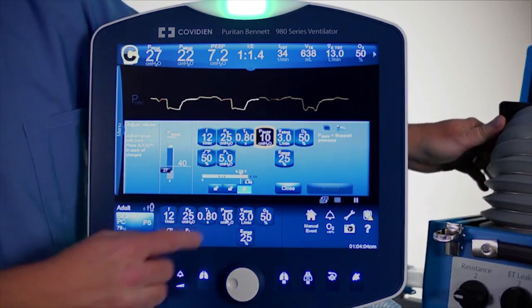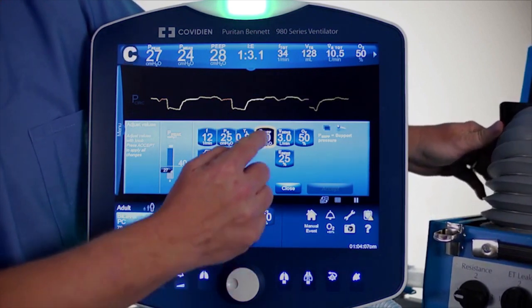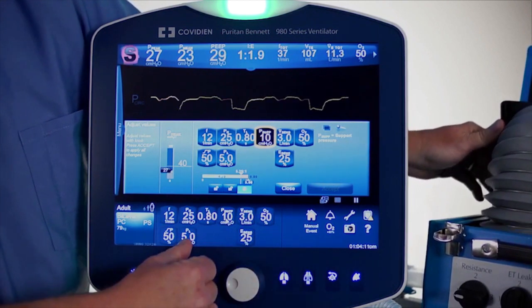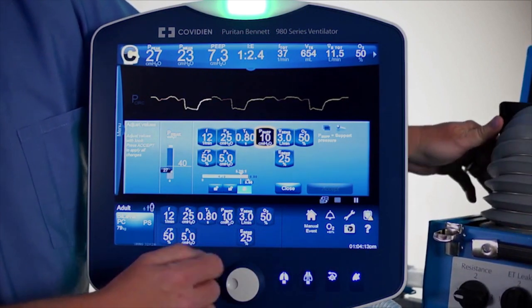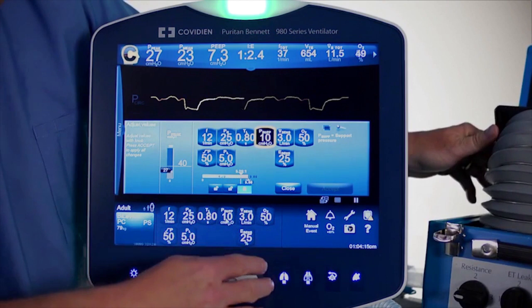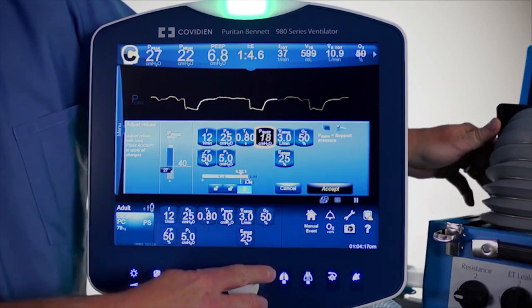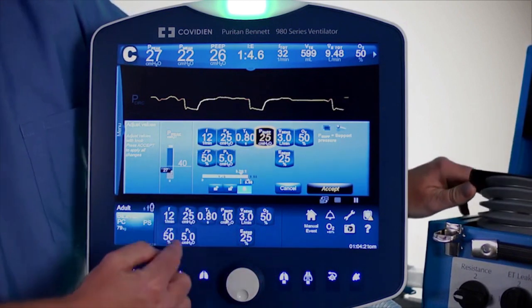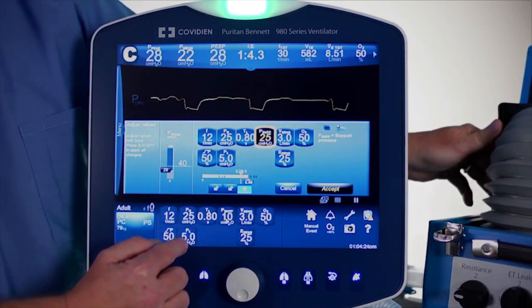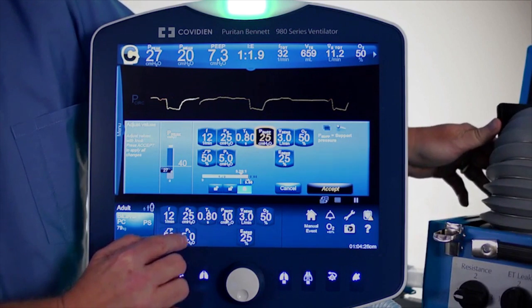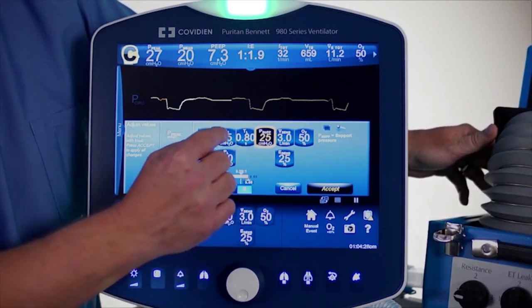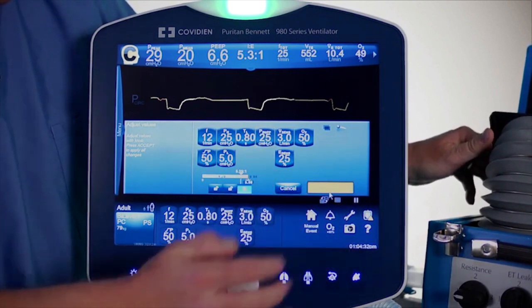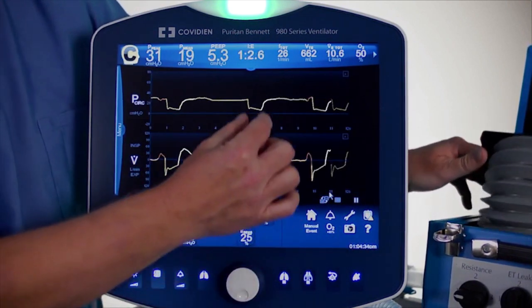Right now the pressure support rises up 10 plus the 5 of PEEP to a total of 15. Until pressure support plus the low pressure exceeds the high pressure, you will not see any pressure support in an APRV-type strategy because the release times are usually so short.